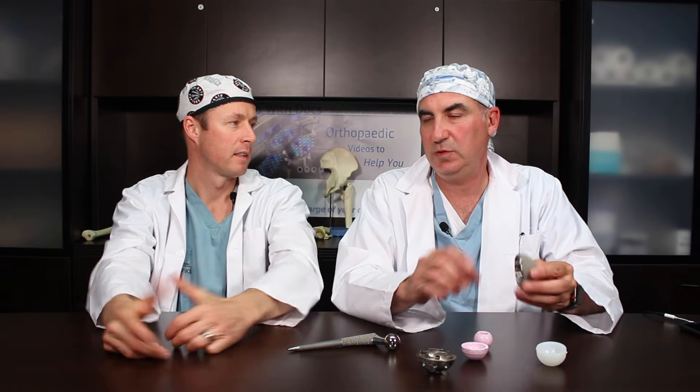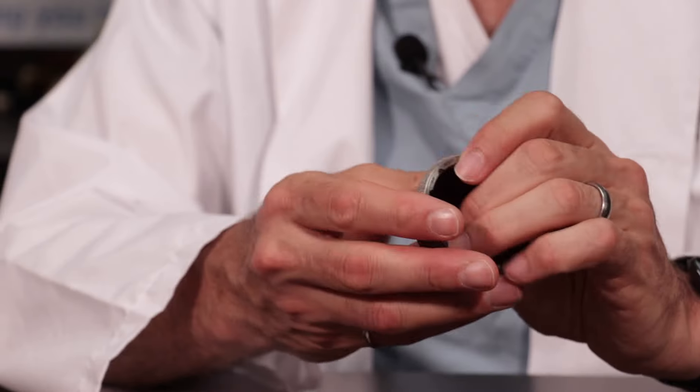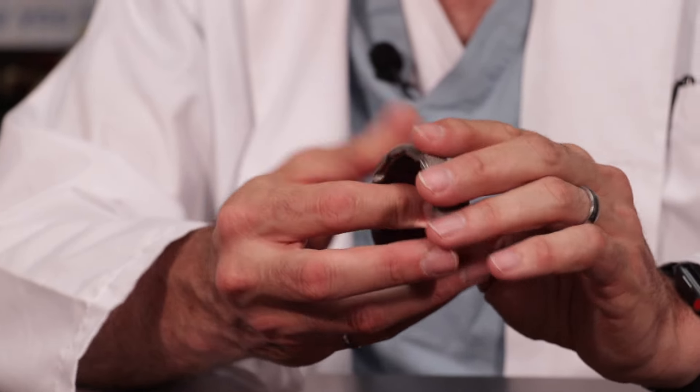The third choice is one you've heard a lot about in the media — a metal bearing surface. We used to use metal bearing surfaces, but they have some problems. When you have a metal-on-metal bearing surface, ions can sometimes be released related to the wear of a metal ball on a metal socket. So that's becoming less common. Check out our metal-on-metal video for more details.